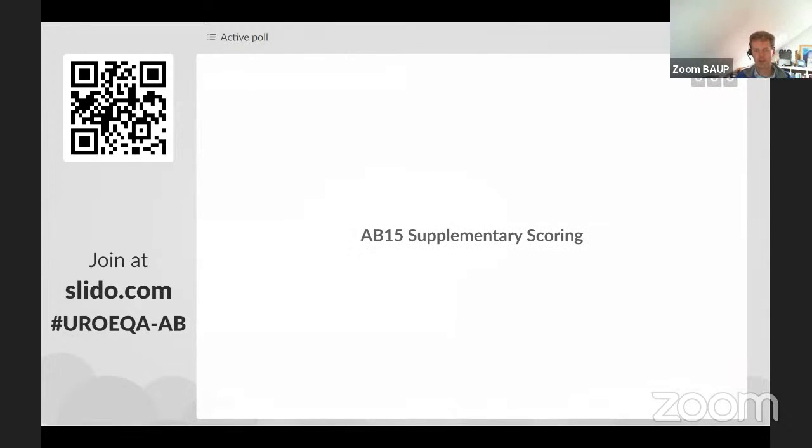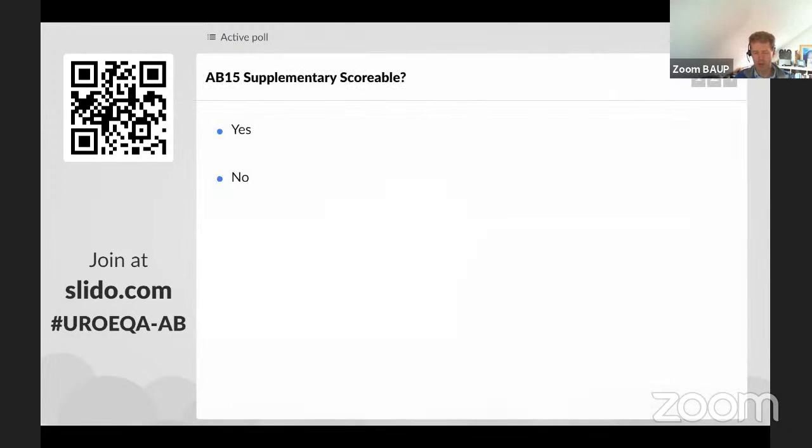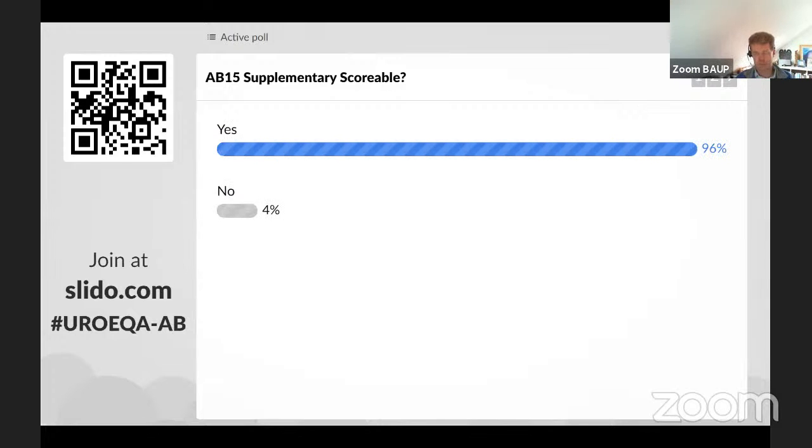So before we get into the scoring, because of the ISUP and GUPS disagreement, the intraductal component may not have been graded by some people. So you're going to get 3+4 or 4+3, depending on which way you grade. So we're suggesting we merge 3+4 and 4+3, and then the others are all wrong. Is that correct? Or you give partial for the 4+4, being 1 grade group away from the merged 2, if you see what I mean, with Gleason grade groups 1 and 5 being incorrect. Okay. Well, we'll let everyone decide on that.